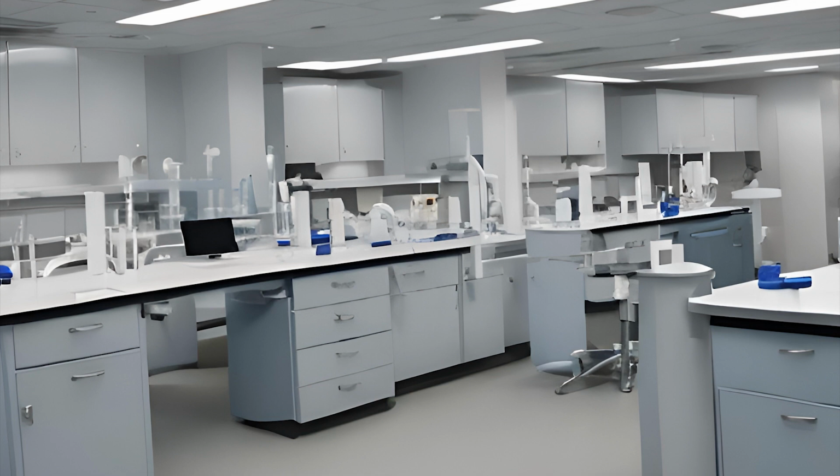Underfilling the tube can be an especially important error when working in coagulation studies, because you need a specific ratio of blood to anticoagulant. And if you don't have that, you're going to get invalid results or the wrong collection time. Some tests have to be done at a set interval. And if they're not tested and drawn at the right time, it's not giving the information that the medical team needs to take care of that patient.